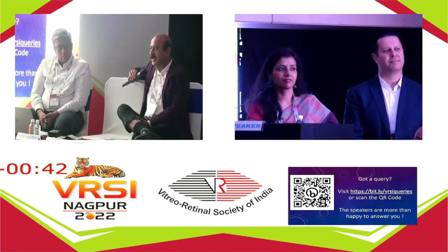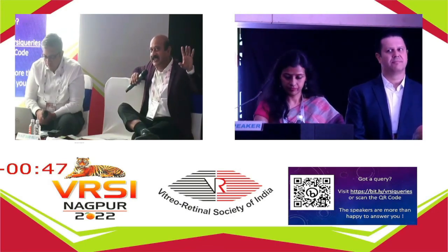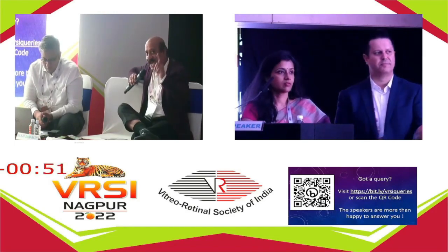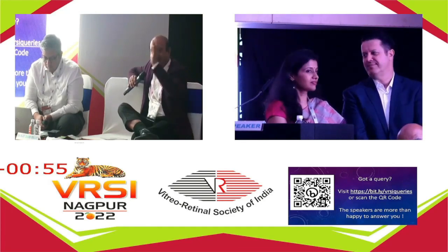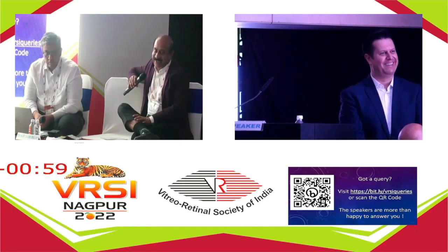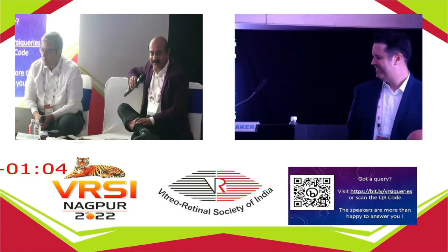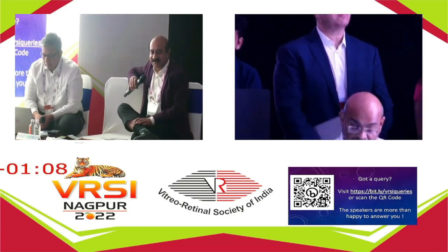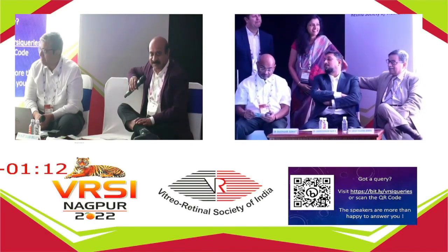I would just make those clarifications. Yeah, except in cases where the media is hazy and you want greater detail, probably the light source. That is, the confocality is mainly because of the light source, not because of other parameters. Well, confocality is only because of the pinhole, right? So either you have a circular or a slit pinhole, or some of the devices let you have all sorts of different modulations of the aperture where you can get retroilluminated light and the like. So the confocality comes from the pinhole.